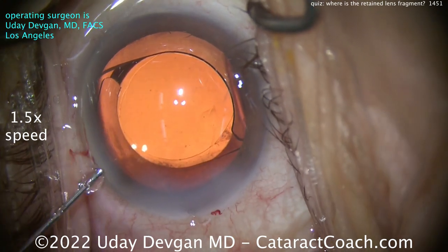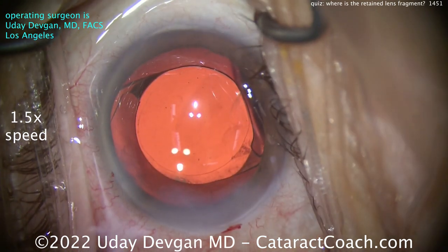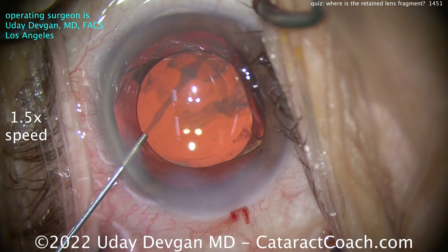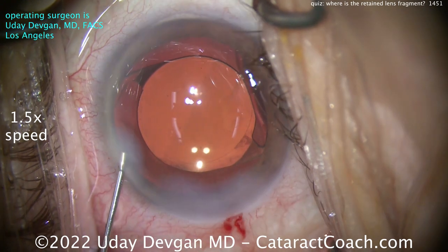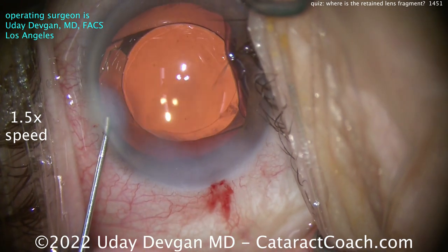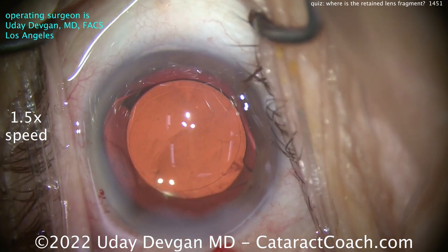Two retained lens fragments — you just never know. Remember, a retained lens fragment at the time of cataract surgery is pretty normal, and it happens to every surgeon, including me and including you. So you've got to be careful — sometimes it's just near-impossible to see those retained lens fragments. Do a sweep around the eye and squirt them out. Even then, if you have a retained lens fragment, you can either zap it with a laser or go back and take it out.